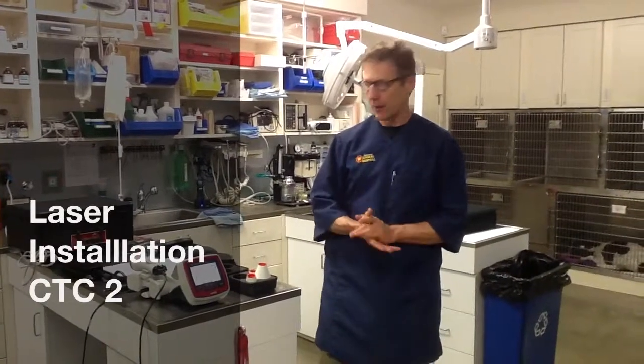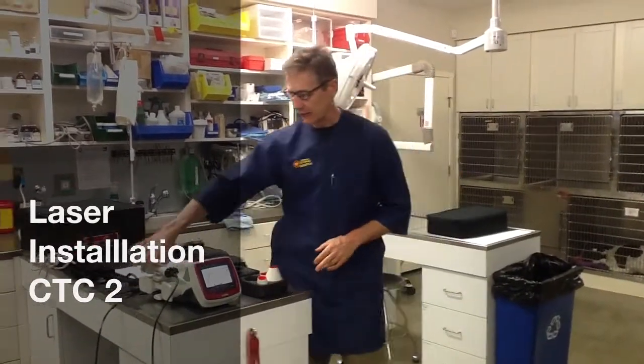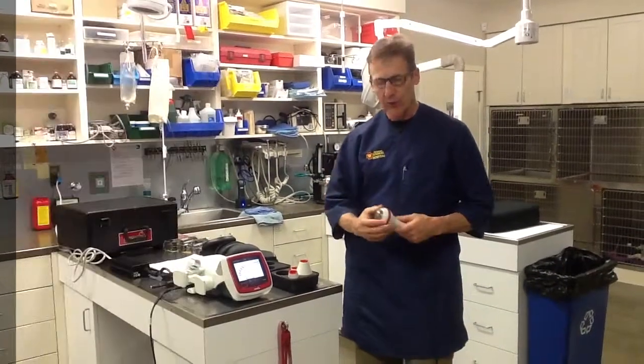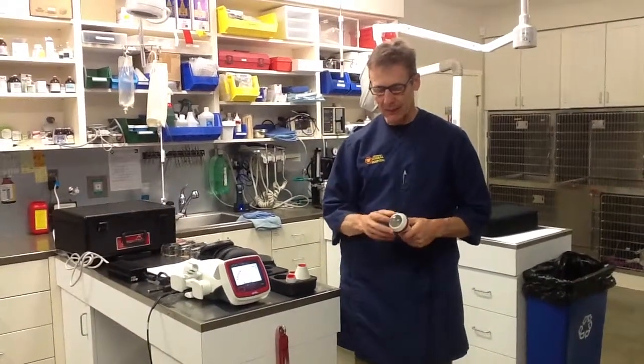What I'd like to talk about now are some general treatment principles. As I described earlier, we have several heads on the hand pieces. The one that we use probably 90% of the time is the large contact head.